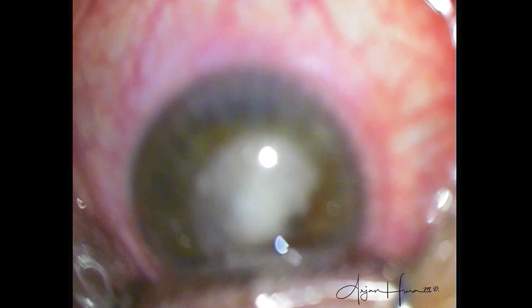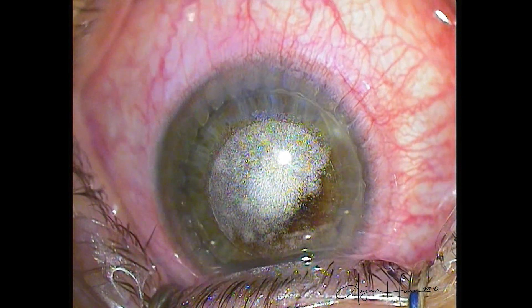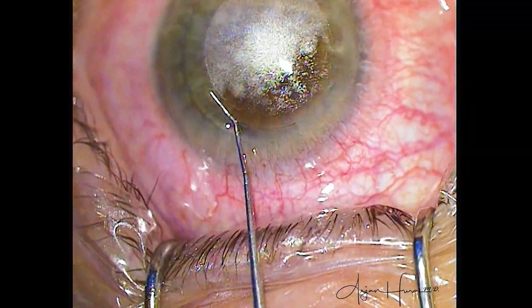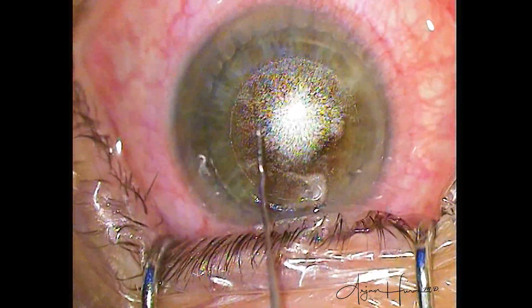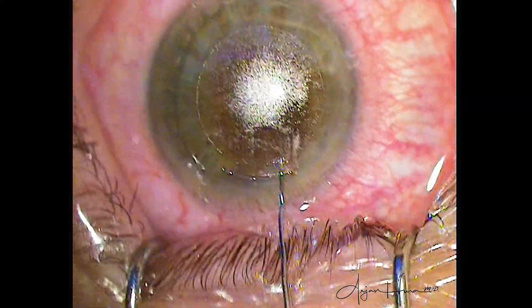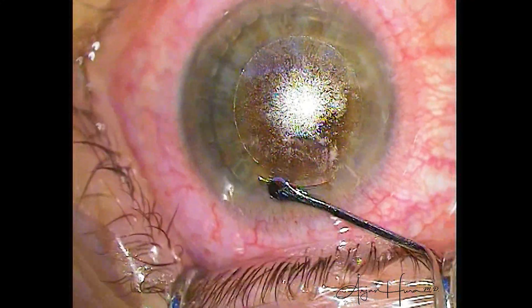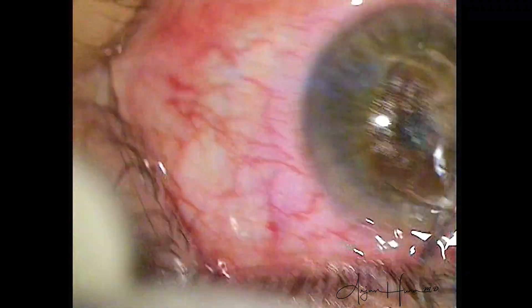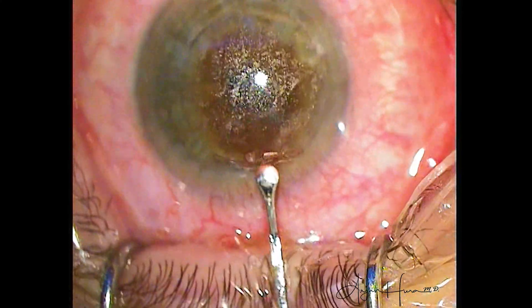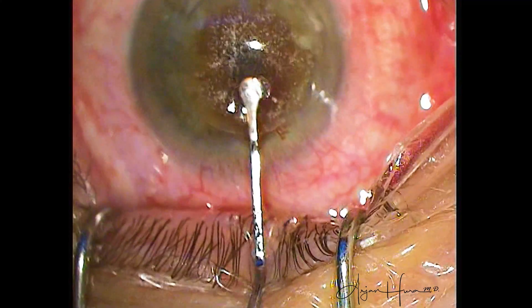As this eye comes into focus, you'll see a lot of air bubbles in the SMILE pocket — they're going to make the patient's vision temporarily blurry, but I'm going to use them as a visual cue to aid me in keeping my bearings. Here I use the SMILE dissector to open up the superior incision, and I tip the instrument anteriorly to delineate the anterior plane. Now I go posterior to the lenticule to define the posterior pocket. There's already a little bit of oozing near the SMILE incision — not uncommon in patients with a long history of wearing contact lenses. You can see blood vessels traversing the superior cornea and encroaching the SMILE incision, and as the dissector is being inserted into the pocket, all the red blood cells are being smeared across the lenticule before it has been extracted.